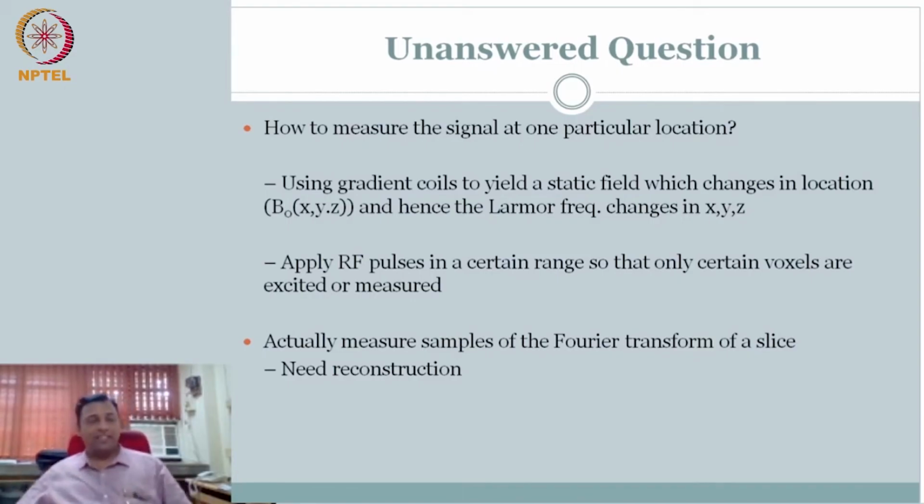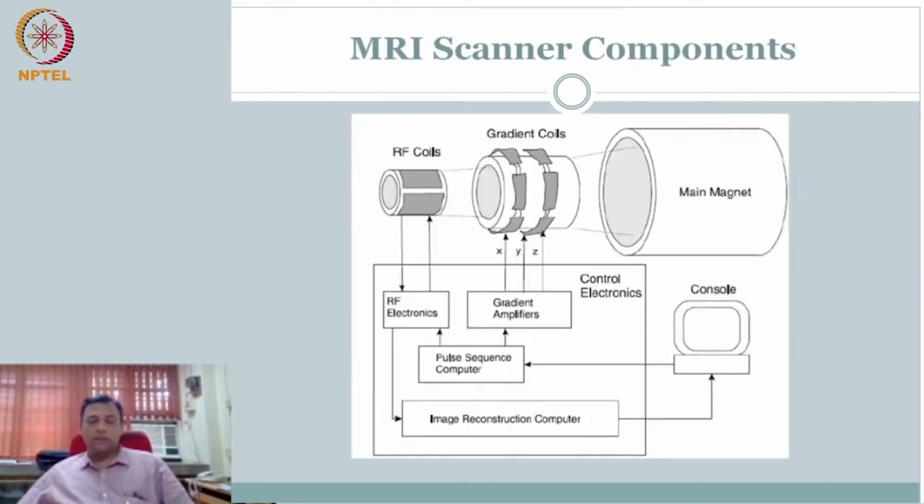So what we are measuring turns out is nothing but the energy in different frequencies, which is nothing but your Fourier spectra, Fourier transform, right? We'll get to that, but start to appreciate that. We go to instrumentation first. So how do we enable this? That is the first goal.